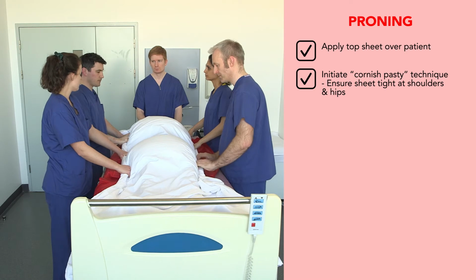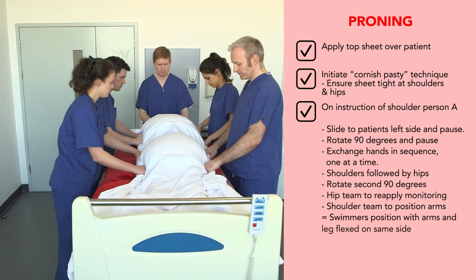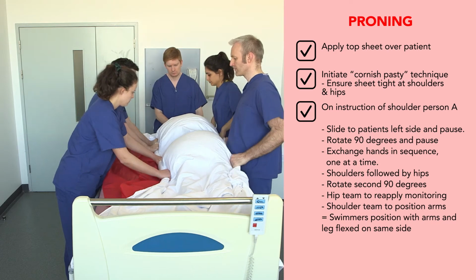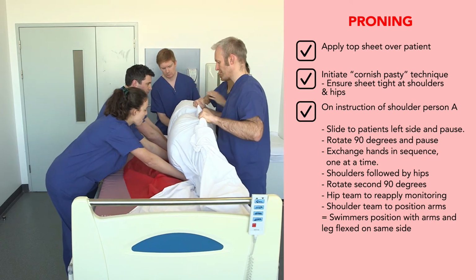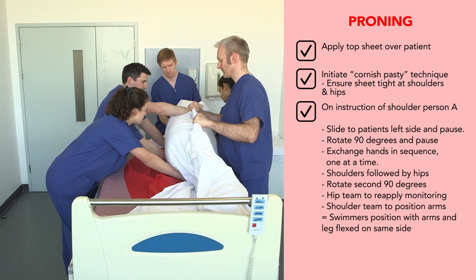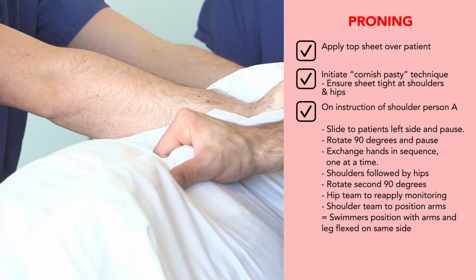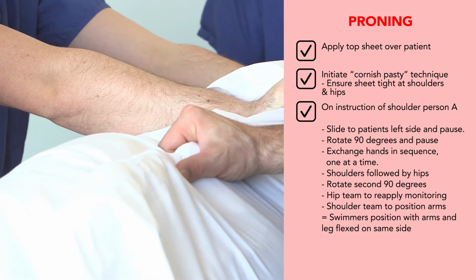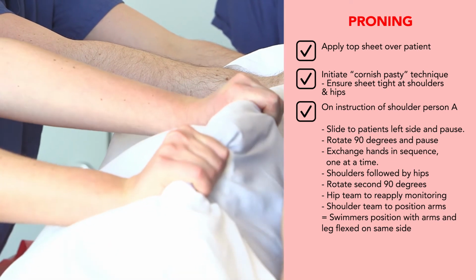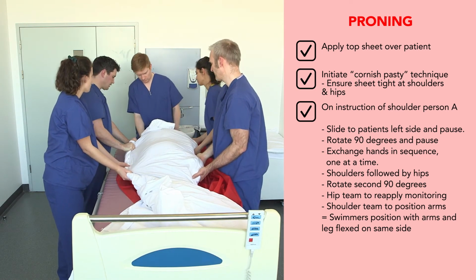Okay, if we're all ready, first movement, slide to the left, ready, steady, slide. Second movement is to roll 90 degrees, ready, steady, roll. And now we're going to swap hands deliberately. Okay. Thank you. Okay. Yep. Got it. Roll. And the patient is adequately in the middle and at the head of the bed.